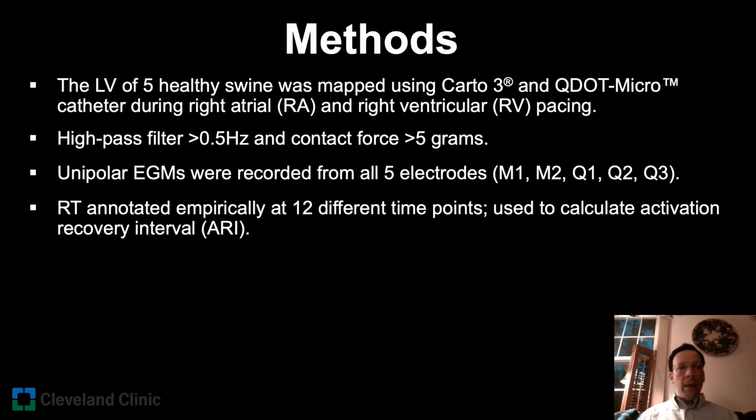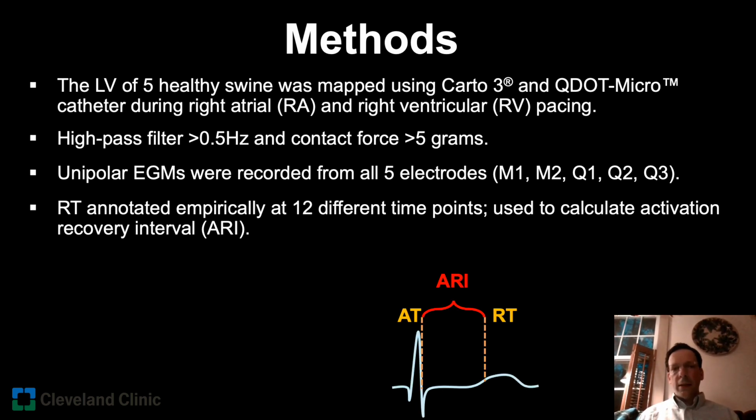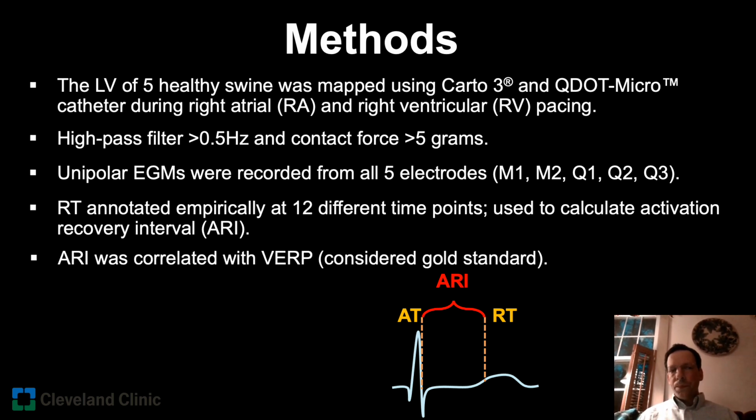Repolarization time was annotated empirically at 12 discrete time points. In turn, the repolarization times were used to calculate activation recovery interval. And this ARI is defined simply as the difference between the local repolarization time and the local activation time.